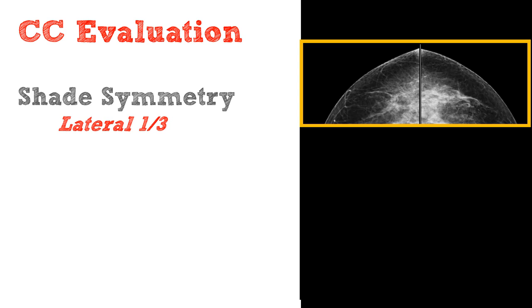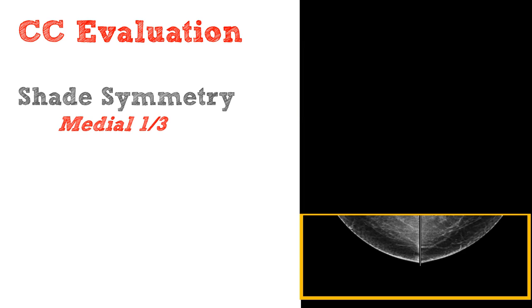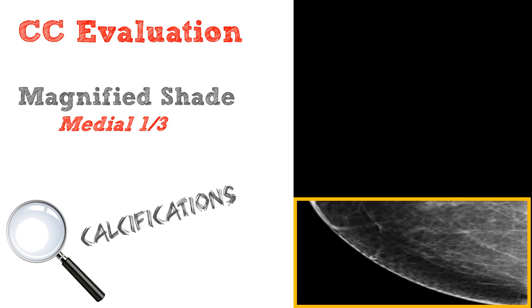From here, we're going to look a little closer at the craniocaudal view. We're going to employ that same shade symmetry technique, this time starting looking at the lateral third of the breast. From here, moving to the middle third, and finally to the medial third of the breast. Next, we're going to magnify the image and again repeat those same steps, but specifically looking for calcifications in the lateral aspect, the middle third, and finally the medial third.